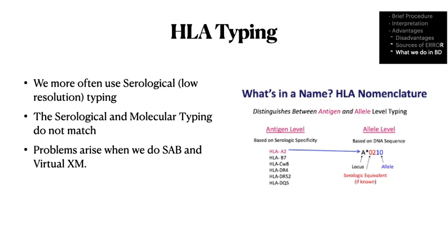This one shows the difference between serological HLA typing and molecular HLA typing. If you are using SAB virtual cross match, we cannot use a serological test. We have to use high resolution typing.